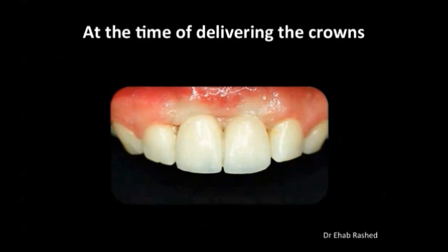If it doesn't disappear in a few minutes, this means that you're exerting too much pressure on the gum. You have to release it by reducing the bulge of the crowns.